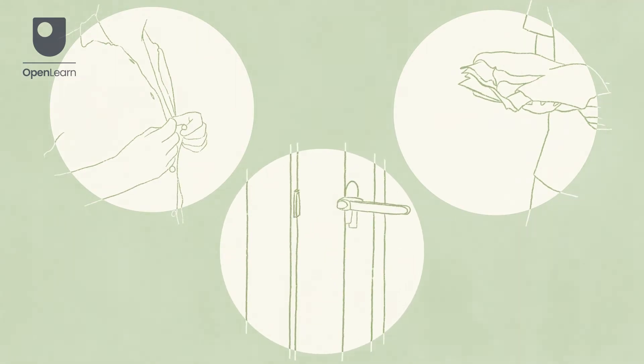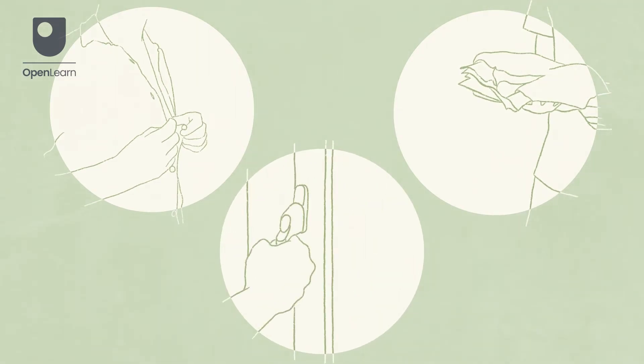Provide a gown or draping if necessary to maintain their privacy during the examination. It is important to keep the patient warm and the area free from draughts for their comfort.